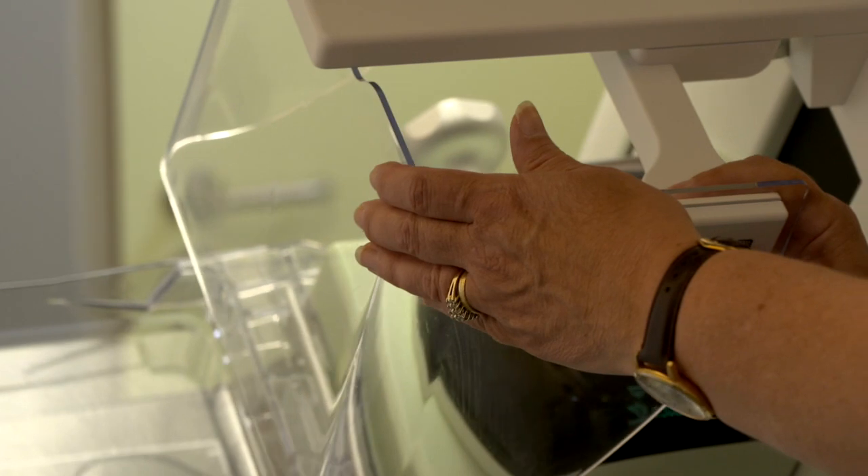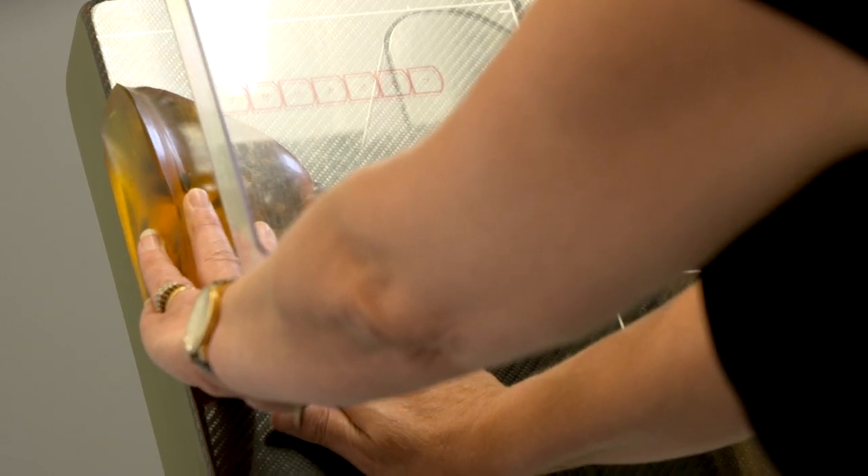By moving the face shield as well I have much easier access and I can position the patient much better. This is quite a nice feature as well for disabled patients because it's easy for them and for us to position.